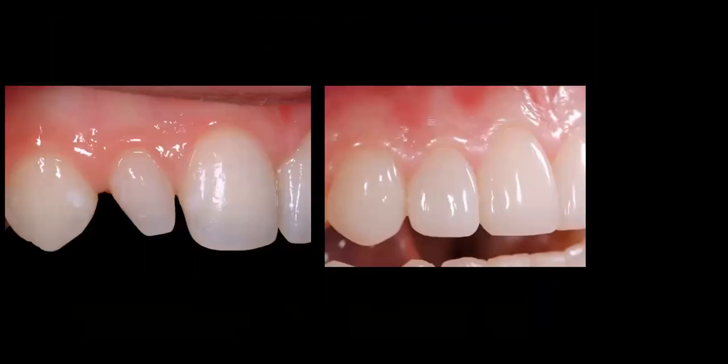When you see this with the infinity edge, if her gums recede, the margin is so blended with the Bioclear method that it's okay for the gums to recede, which they are going to move as these teeth continue to erupt until the girls are in their mid-20s. So yeah, I think Disha, that's great.